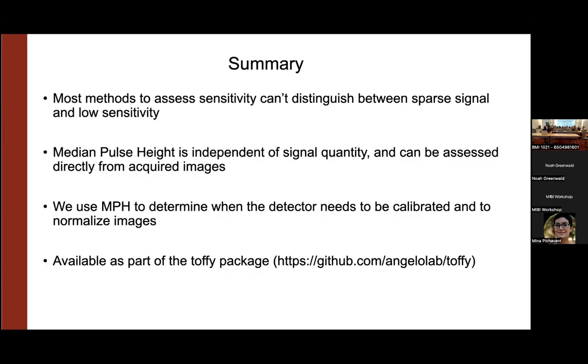I just have a quick question. So relating to your discussion of other sources of variation beyond technical from the machine, for example, how well tissues are preserved during that initial fixation process. Is there a method to potentially normalize based on that, or is that maybe not necessary?